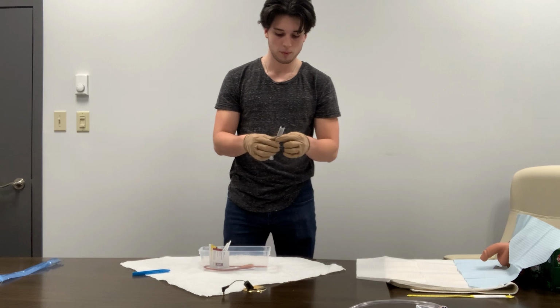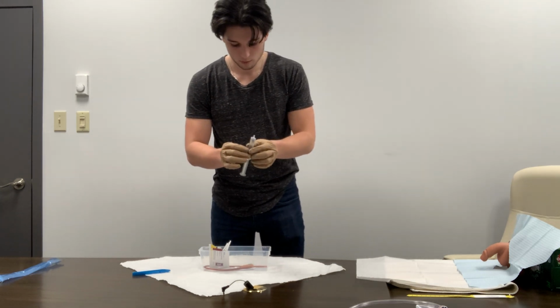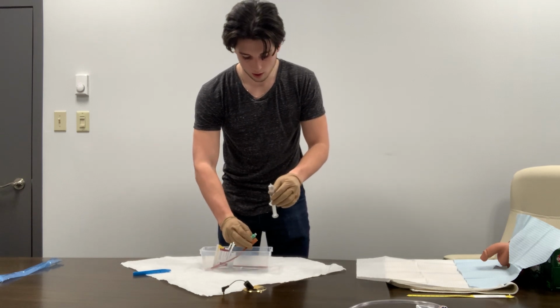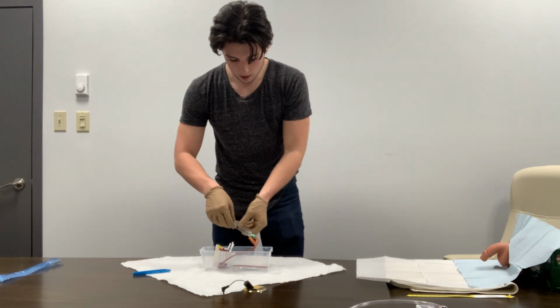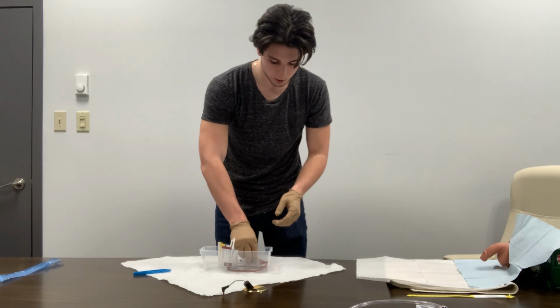And so now that we have that ready, we will also be attaching our 10 ml syringe to our catheter. So we can uncap it here and just throw out this cap. And then we'll be inserting it into the port of the catheter. So we will be inserting it in here. And now that that's inserted, we can grab our lubricating gel.